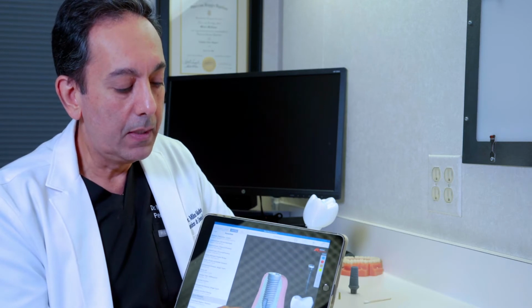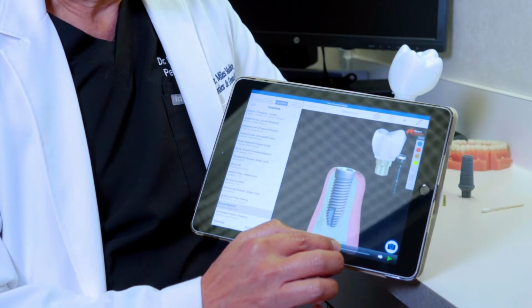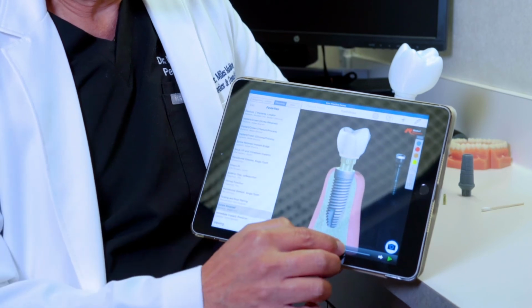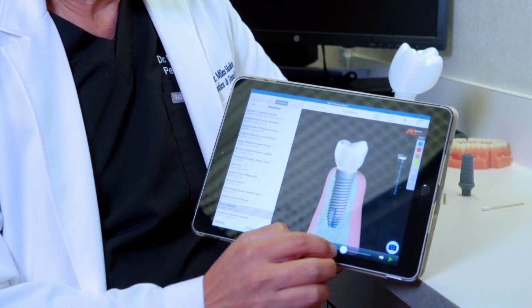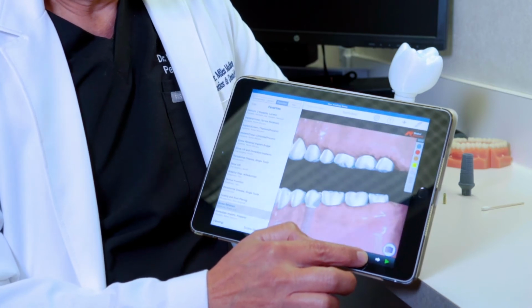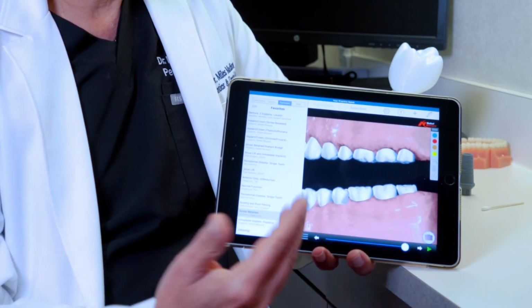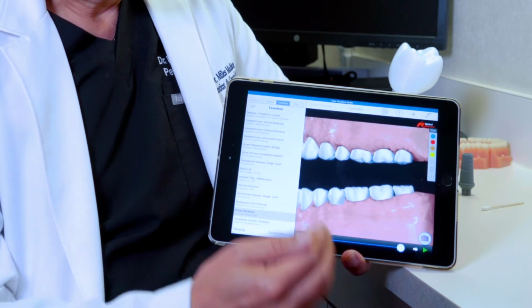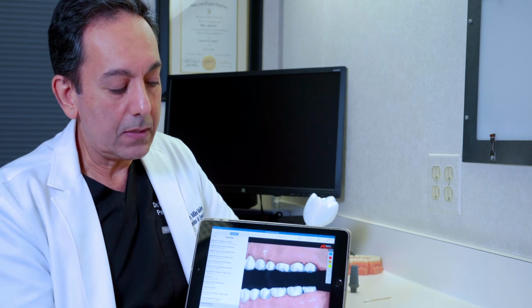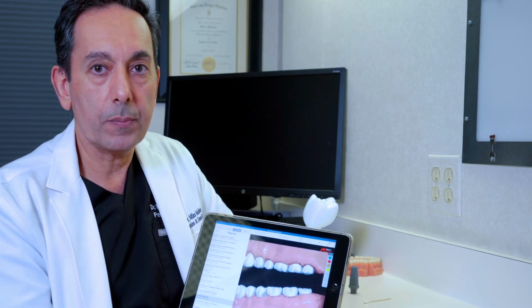And then at that time, an impression is taken of this area, and what we make is something called a crown, which is actually the part of the tooth that you chew with. That's secured to the implant with a small screw right through the middle part of it. But when everything is done, this is the only thing you see. You don't see any part of the implant or the screw or anything like that. So it acts and functions like your own natural tooth. And when it's done properly, it's very difficult to tell if it's a natural tooth or a dental implant.